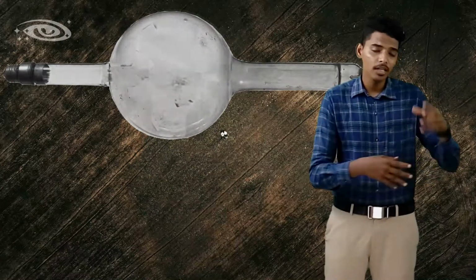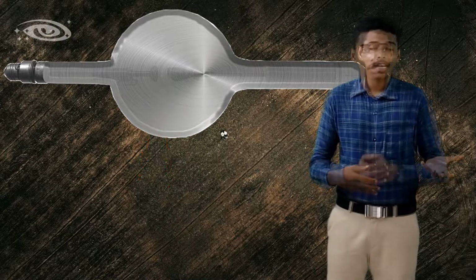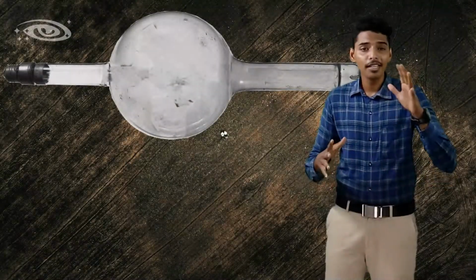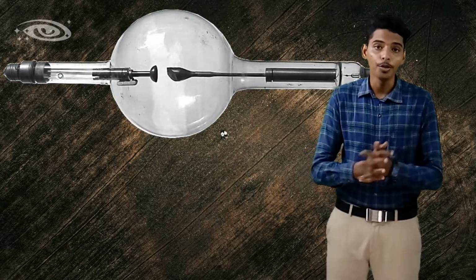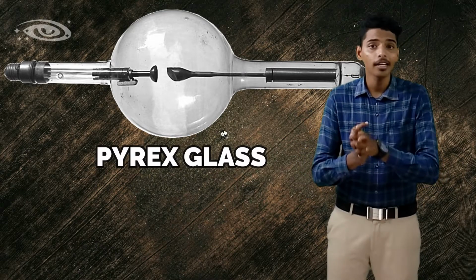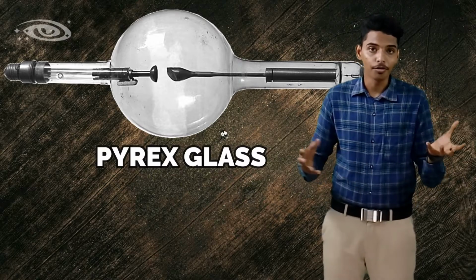Instead of glass, if you use any metal, it is going to attenuate the X-rays and reduce their intensity. And fourthly, glass can be fabricated into any shape. And fifthly, it can withstand an enormous amount of heat without breaking down. Because of this reason, glass is used to make X-ray tubes. And Pyrex glass is used because Pyrex is the strongest glass; it can withstand an enormous amount of heat. And that's it about the glass envelope.